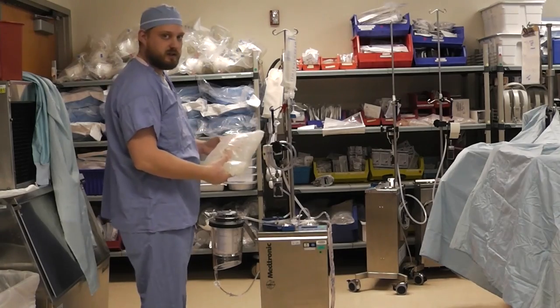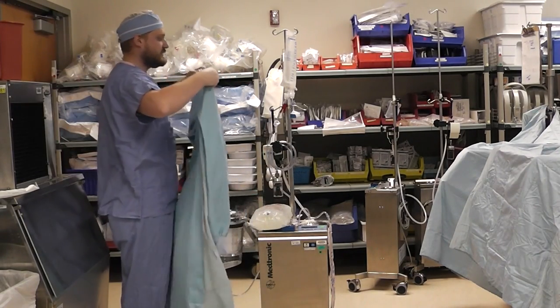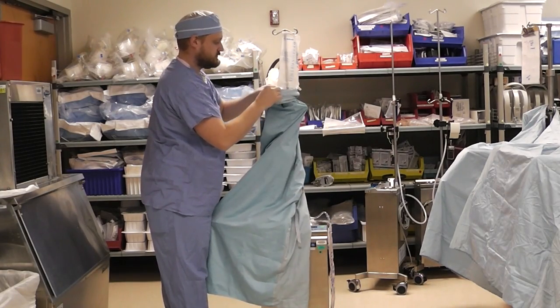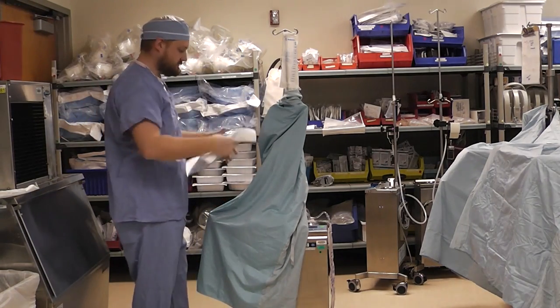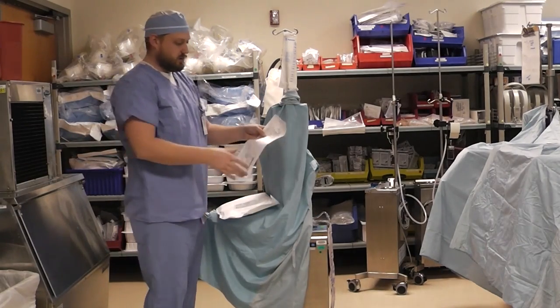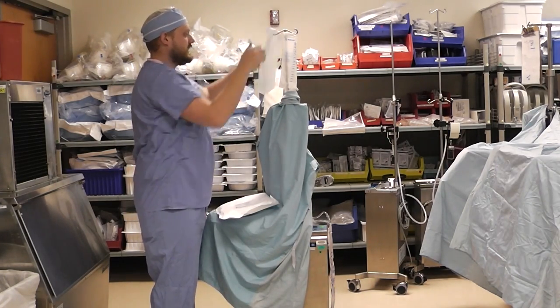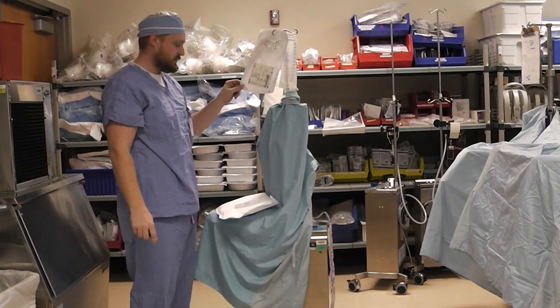Lastly, we are going to take our 3 liter saline bag, set it on top, we are going to cover the cell saver with a gown to try to keep it sterile, we are going to grab our table pack, set it on top, and we are going to take that label from the wash kit, poke a little hole in the top with the pen, and hang it so that the next perfusionist has this information available to them.